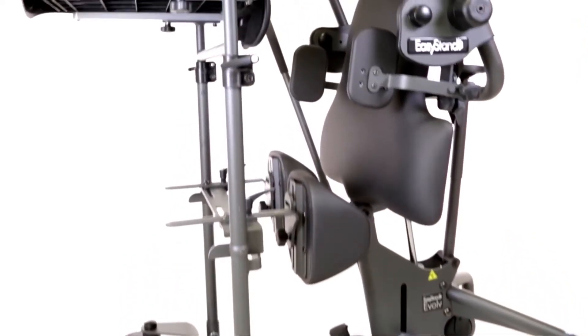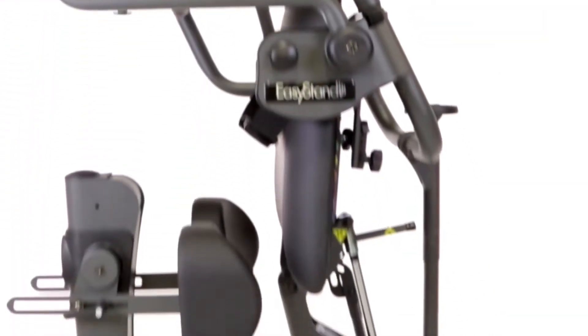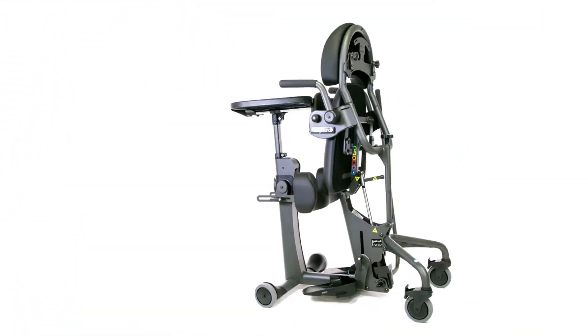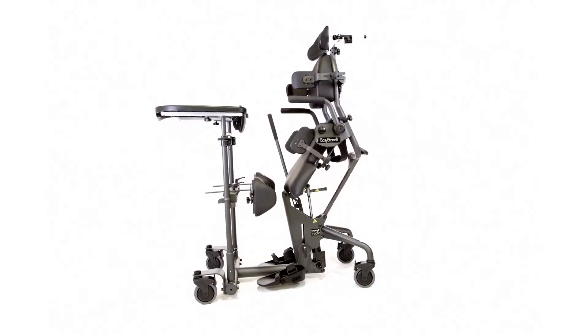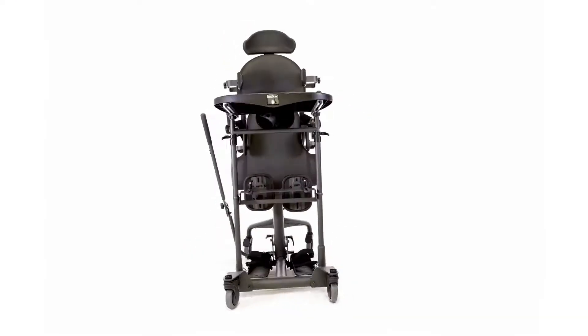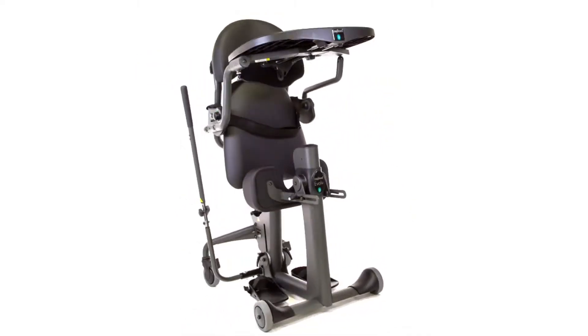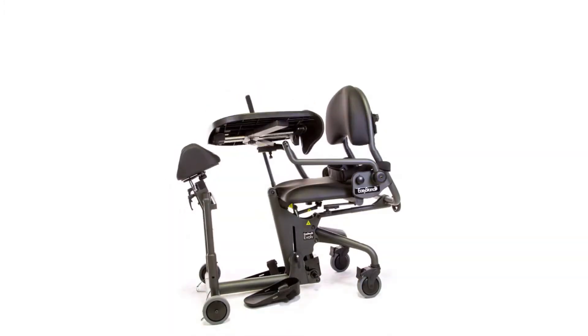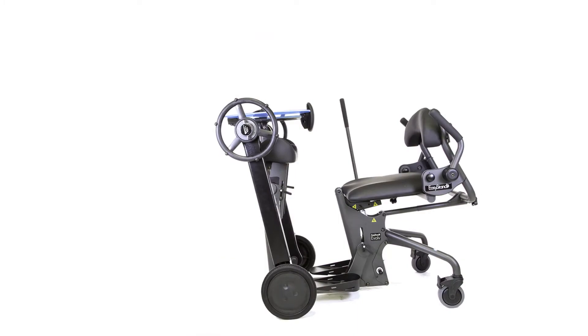Presenting the Easy Stand Evolve, the most innovative stander available. It's available in medium, large, and XT, and can be configured with a standard front, a swing-away front, a shadow tray, a shadow tray with swing-away front, or as a mobile.